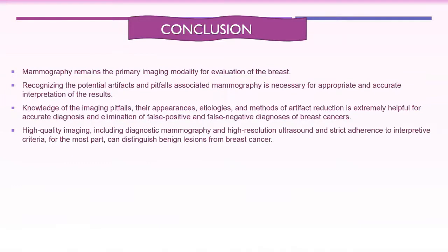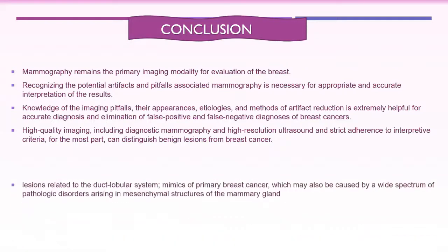High quality imaging, including diagnostic mammography and high resolution ultrasound, as well as strict adherence to interpretive criteria, for the most part can distinguish between benign and malignant processes.